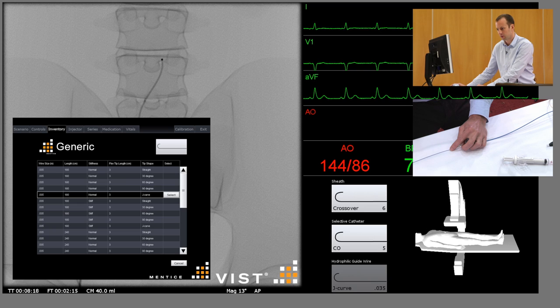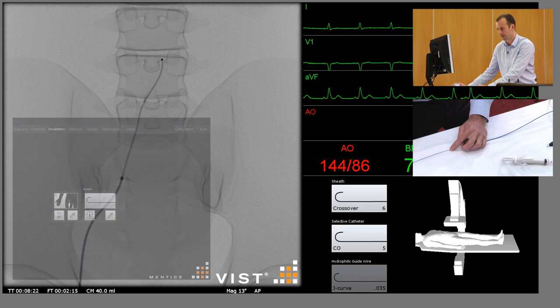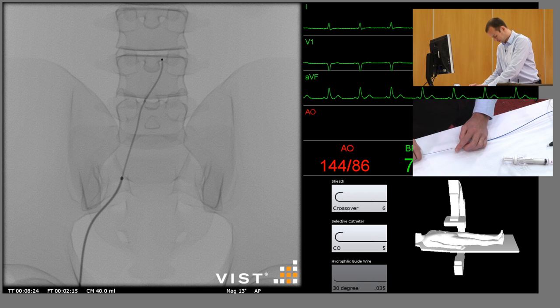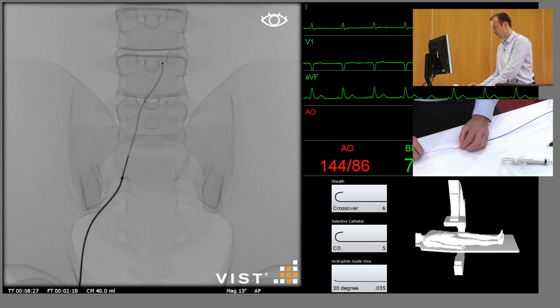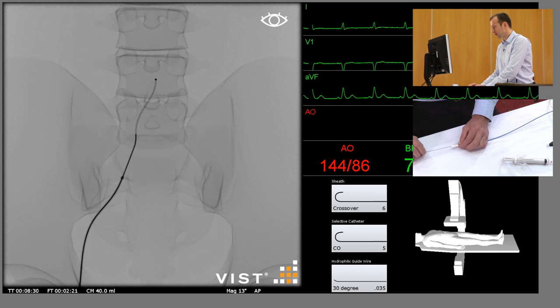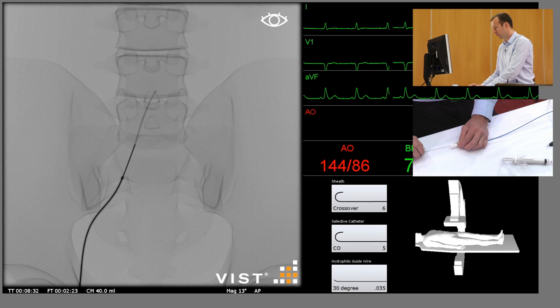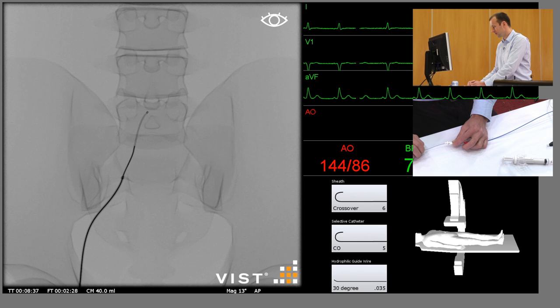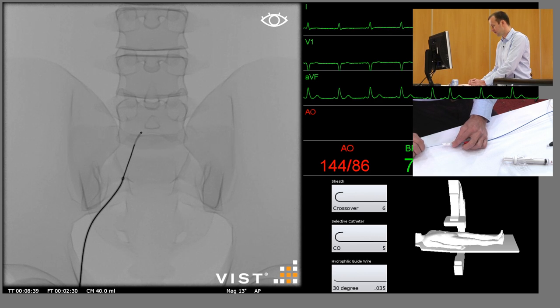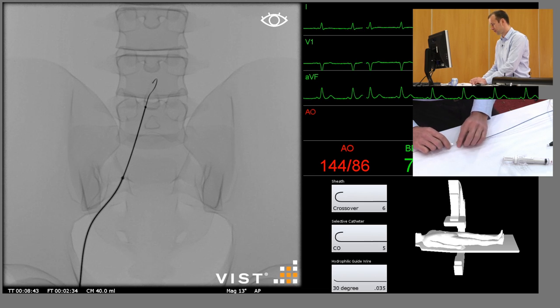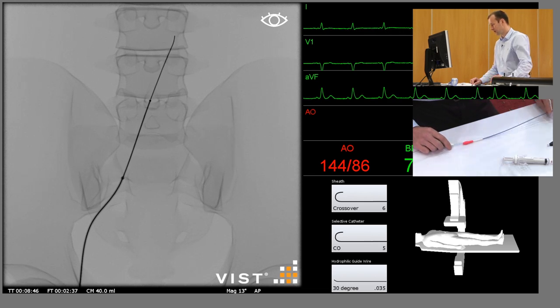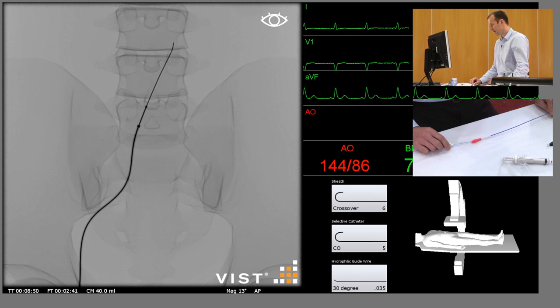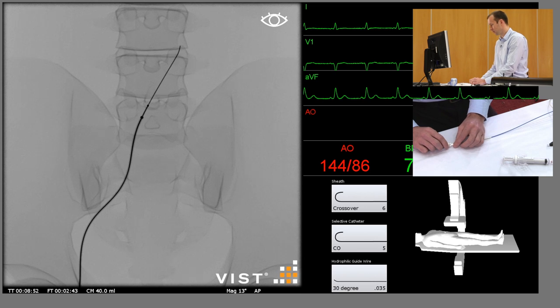So we're just going to use an angled hydrophilic wire. We're going to withdraw the selective catheter down to the level of the aortic bifurcation. At this stage we're going to advance the sheath to give us a little bit more support, and this is a curved crossover sheath as well.